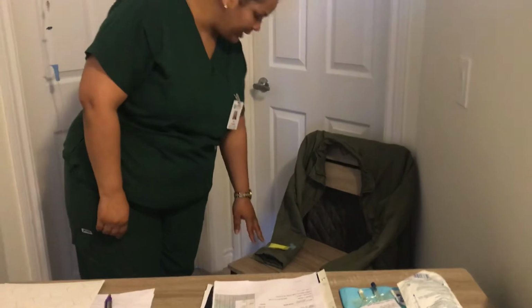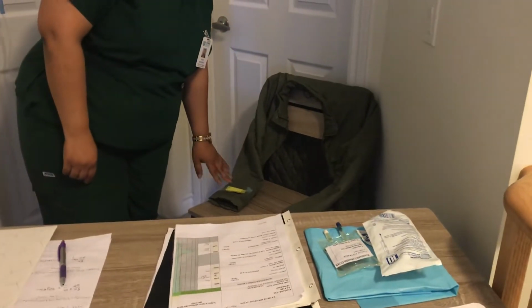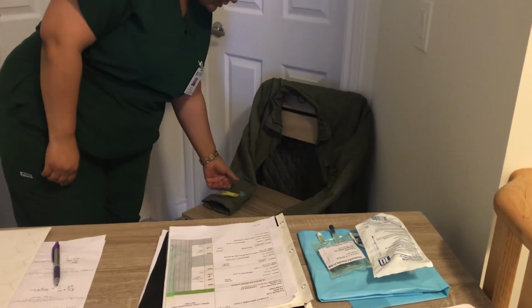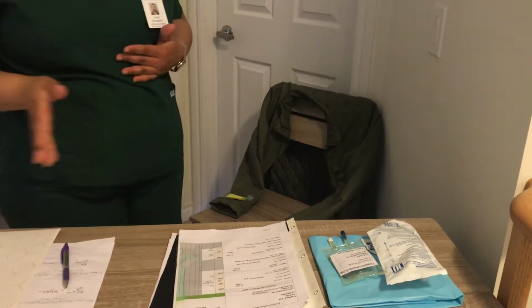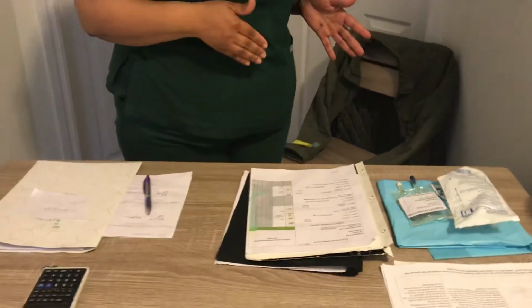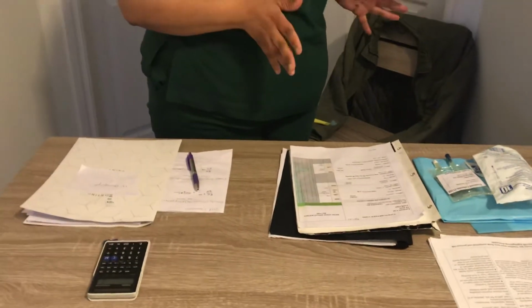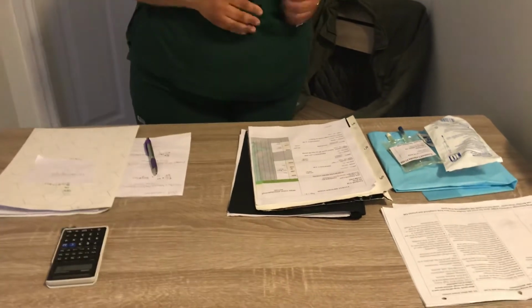So now I'm going to go over to the patient's IV site. And I'm checking for any infiltrations, any phlebitis, any inflammation, edema, or leaks. None of that at all. And when I touch, it doesn't feel hot or cold to touch at all. So it's okay. Critical thinking, I've already assessed my patient's pain levels. And I've already assessed his vital signs as well, which are within normal baseline range for the patient.